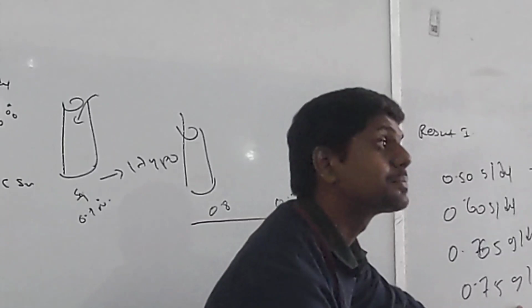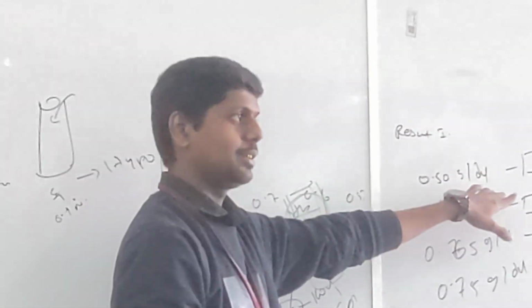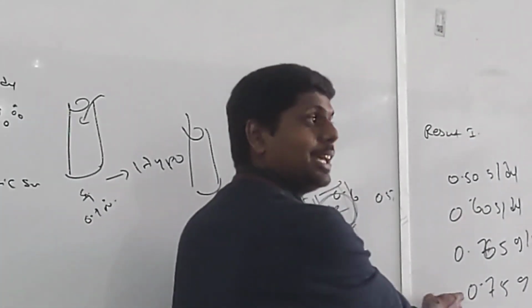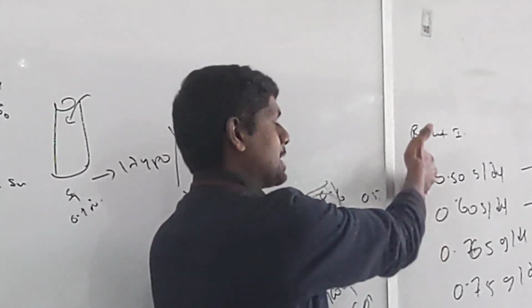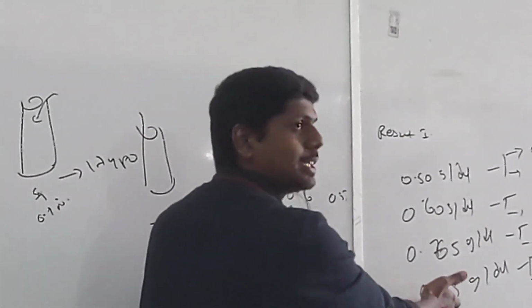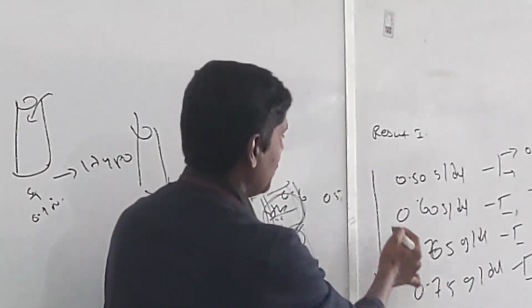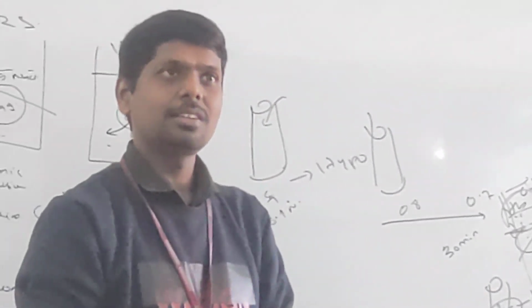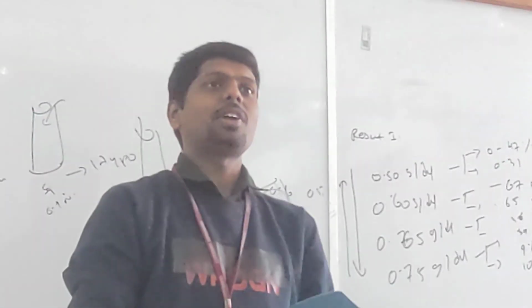That is severity. Severity of lysis can be seen here. If it is already abnormal, it can lyse here only. If it is good, it can withstand up to here. A good RBC will withstand higher levels, but an abnormal RBC will be destroyed at the lower levels. This depends on whether we are seeing these values in ascending or descending order. Anyway, you got the point, right? Get ready for the test on the osmotic fragility test.